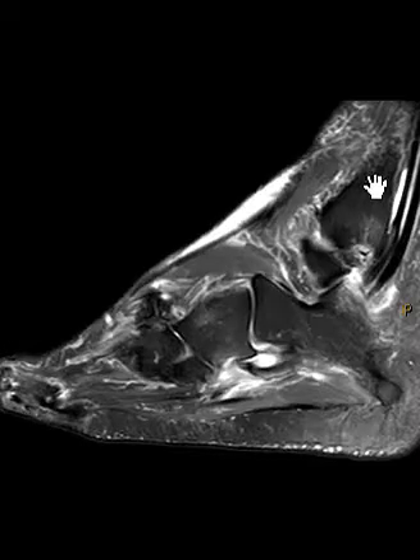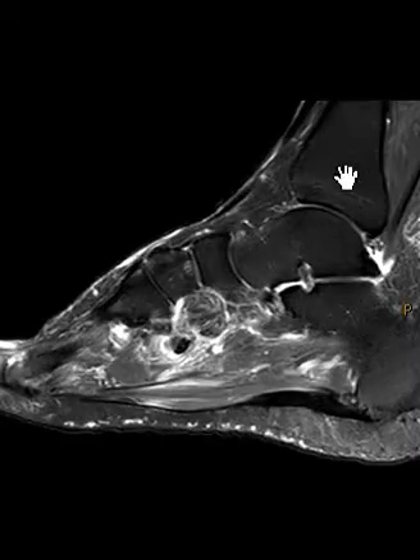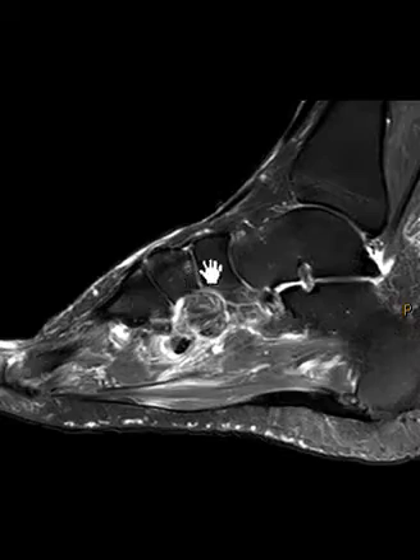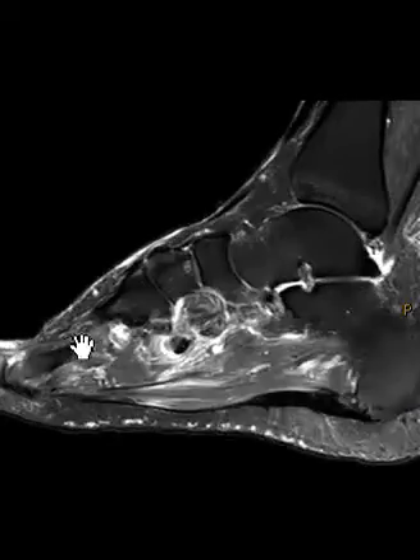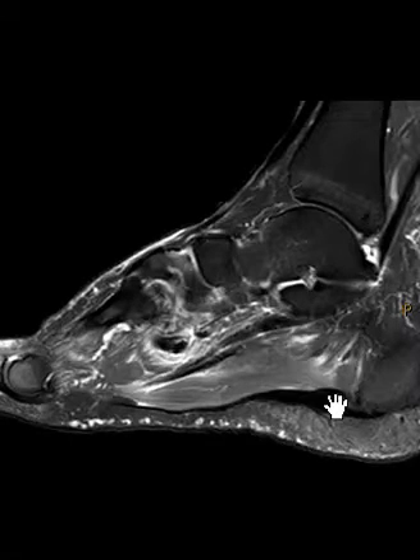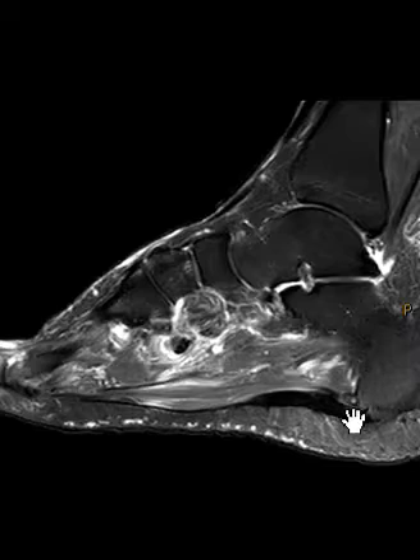I'm going to start with the sagittal view. The sagittal view has the ankle in the back, the calcaneus is down here — the heel — and this is the midfoot area. Here's the forefoot area to get oriented. Here's the top dorsal part of the foot, and here's the plantar aspect. You see this thick band, the plantar fascia back here. There's a big spur from the bottom — a calcaneal spur.